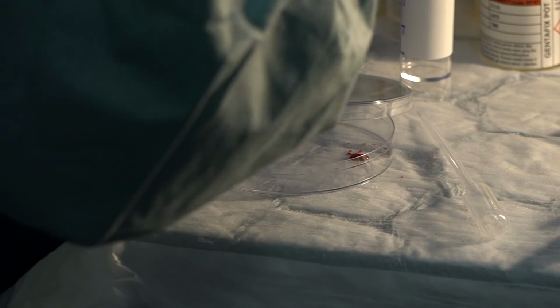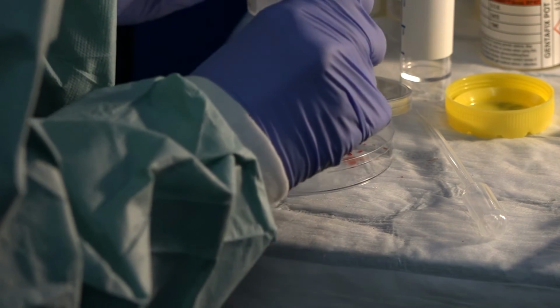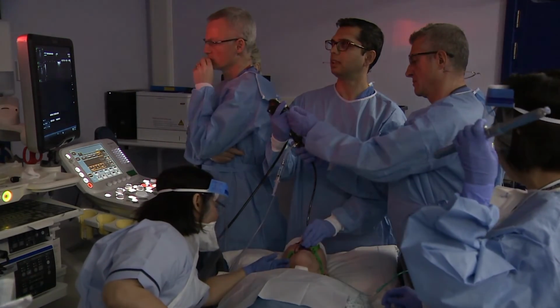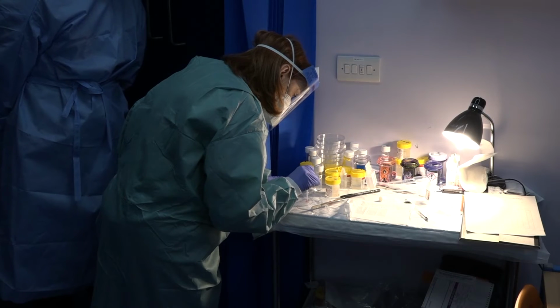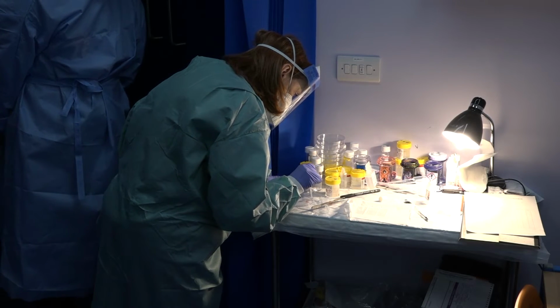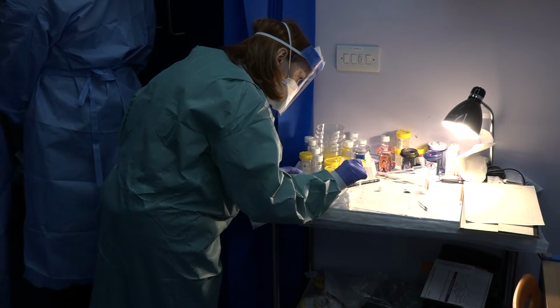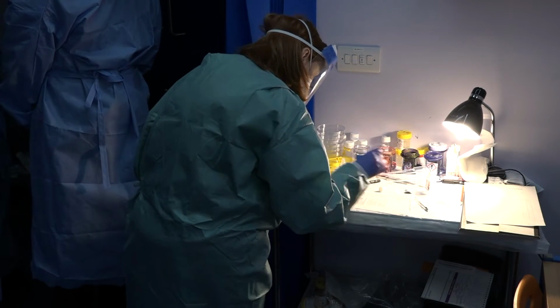Perhaps. Ladies, where have we kept the local? Thank you. Yeah, go for it. Alright, so we're just putting a little bit more local anesthetic here. Give it about half a minute or so, and it will help to settle your coughing. Sorry, Andy, 1 second.